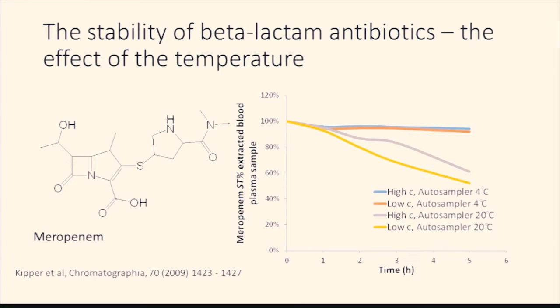Firstly, the antibiotic called meropenem, which has the beta-lactam ring, is known for its instability when the temperature is increased. Stability tests were conducted at two different temperatures. At plus 20 degrees in the autosampler, rapid degradation of meropenem occurred over a five-hour period, and only approximately 60% of meropenem was left in the sample. When the autosampler temperature was lowered to 4 degrees, the meropenem samples over the same time period were more stable.